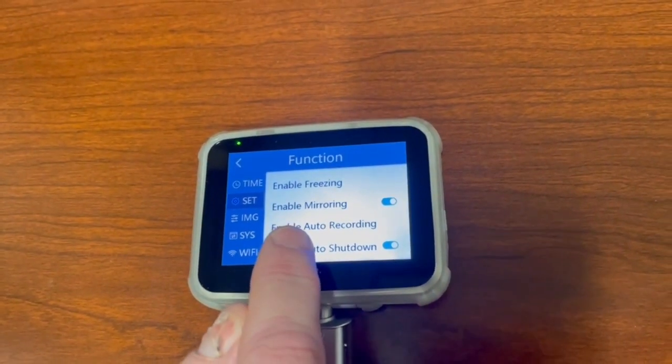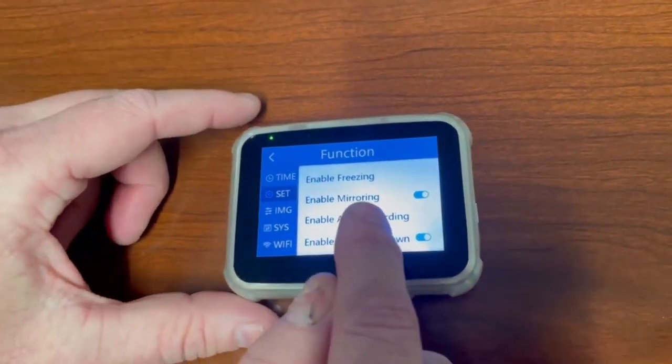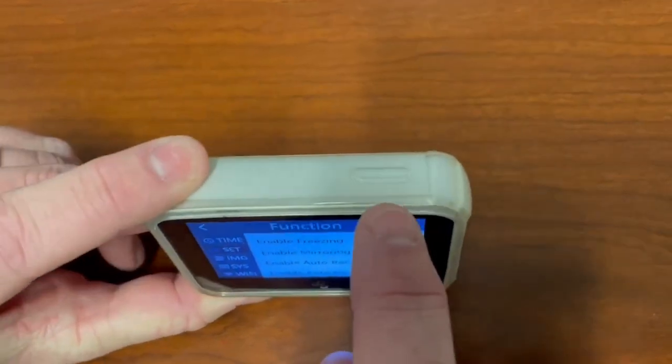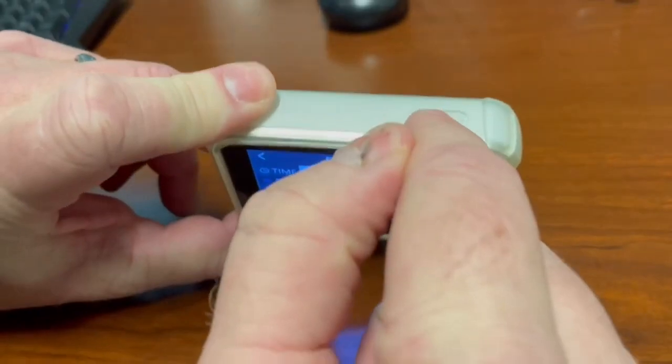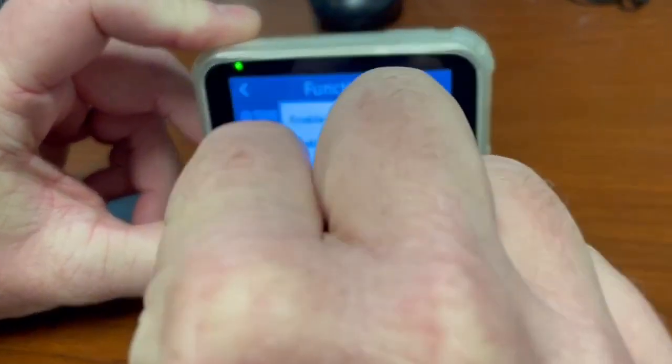You want to keep your enable mirroring on. When your enable mirroring's on and you go to do a face-to-face intubation, you're going to push your on button once, and it's going to take your screen and flip it for you.